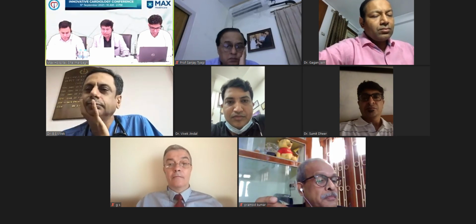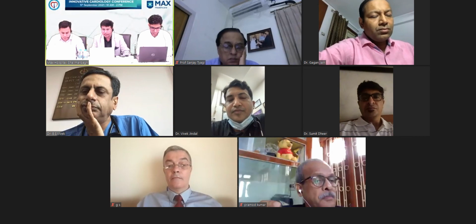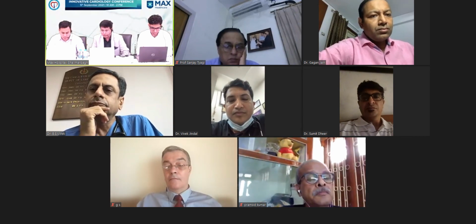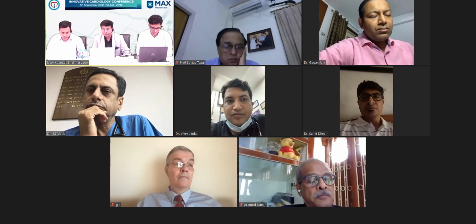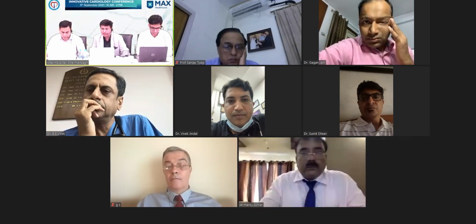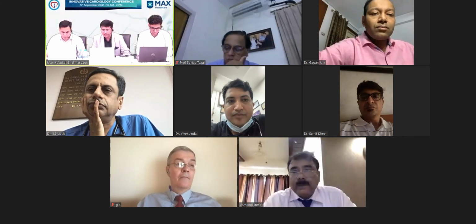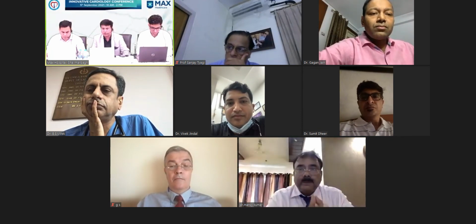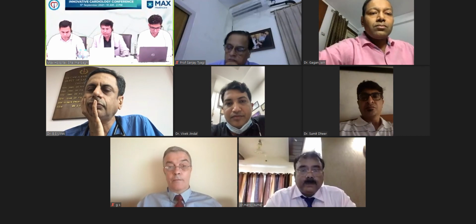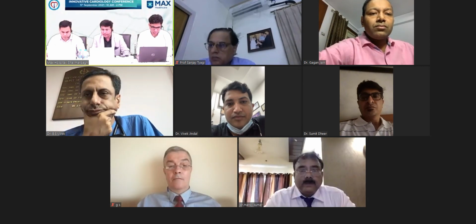then if the calcium score is high, 3 or 4, because the deep calcium is there, you can go directly with intravascular lithotripsy. If there is a superficial calcium also, then you can go with rota ablation, then pre-dilate again. If the optimal result is there, go with the stent deployment. If suboptimal, then you can switch over to lithotripsy again.